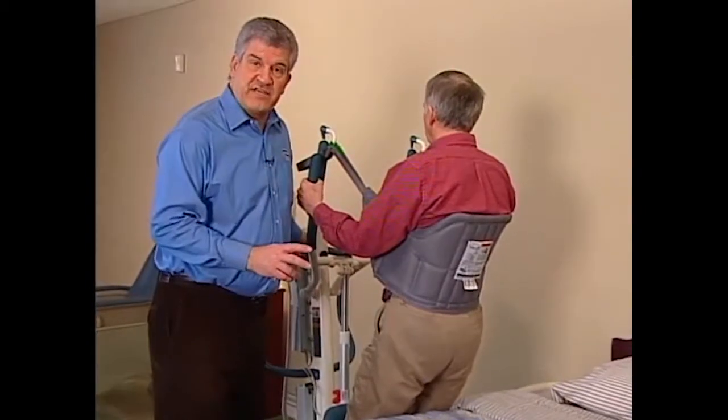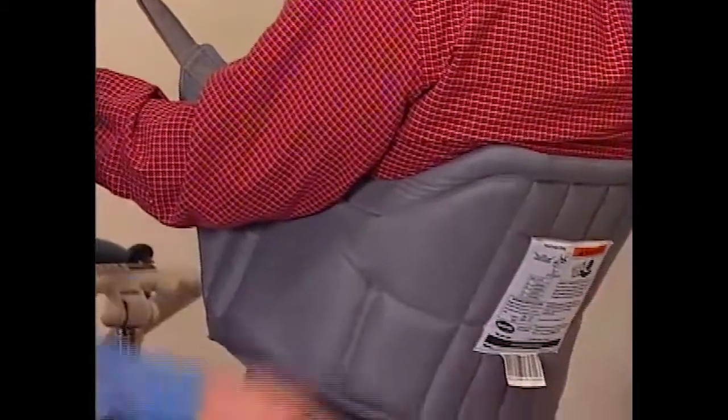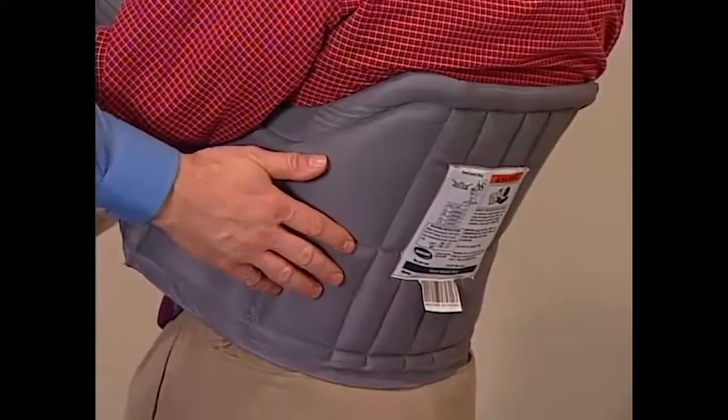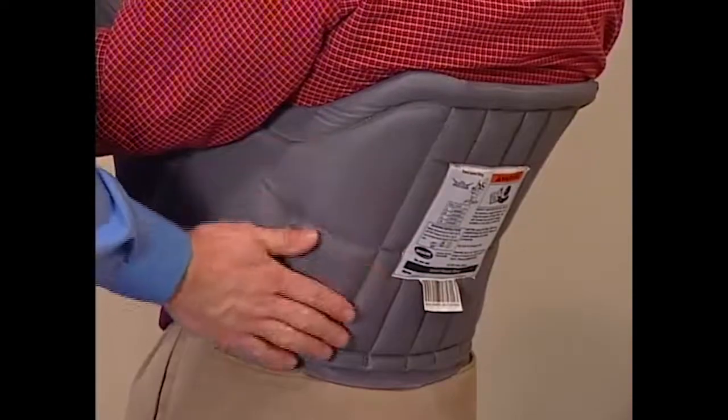Always check with a physician before selecting a sling. Invacare Standing Slings are constructed of durable materials that resist deterioration from moisture and laundering. They're constructed of a unique, fully padded fabric that forms a soft yet supportive surface.